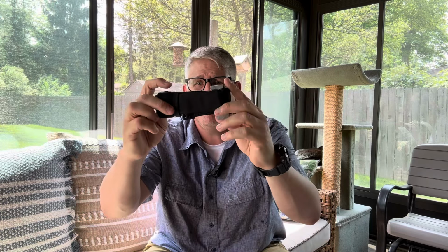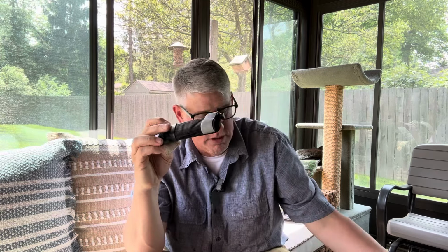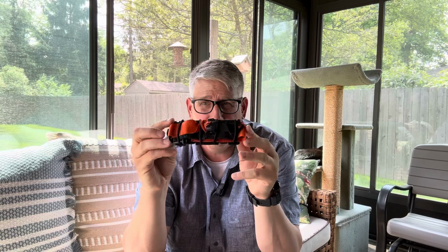Now, if I'm rolling the lowest profile that I would have on a day-to-day basis, I'll show you what that would be. That would be a pocket carry situation. That would be my flat packed CAT tourniquet, and I pack it in such a way, I use a Ranger band on it to keep it really secured. It's really, really small, and you could alternatively insert a SOFTT-W. As shown here, you see the Phlster flat pack, which is another great solution.